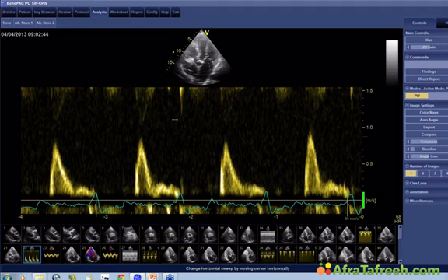So here is diastolic function. You can see that we have a very tall E wave and a fairly small A wave. What you should appreciate, though, is that the A wave is probably just this little part here, and this curve that we see is not really the A wave, but a so-called L wave. This wave occurs during the phase between the E and the A wave, during diastasis, and there we have a sign that the patient actually has elevated left atrial filling pressures. So we have a very tall E wave, a very small A wave, and an L wave.